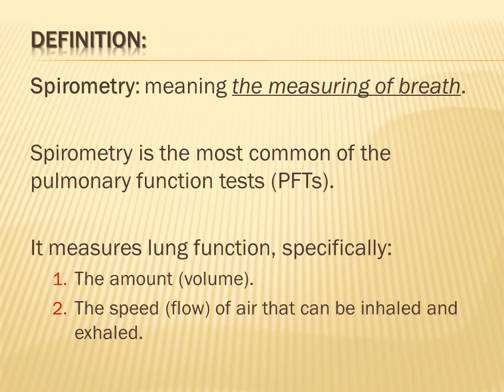This test measures lung function and capacities. So it covers two things. First, it measures the amount or the volumes of the lung. And second, spirometry enables us to measure the speed or the flow of air that can be inhaled and exhaled.